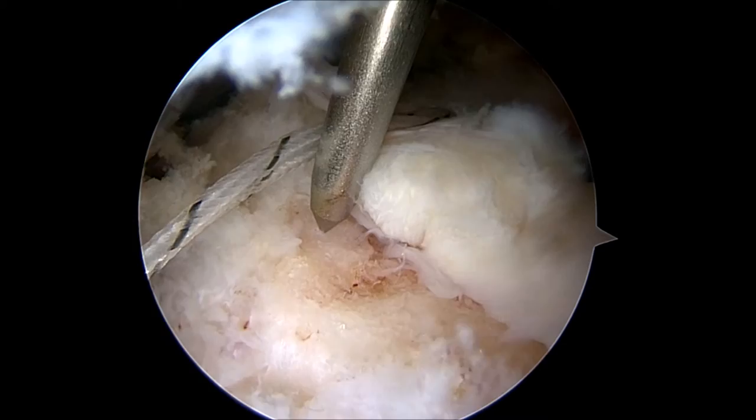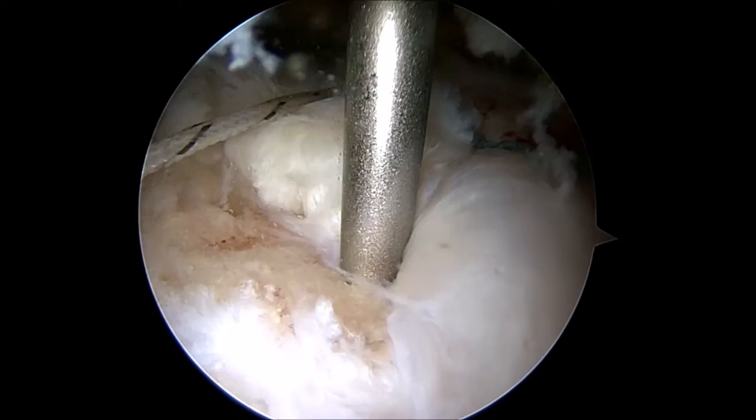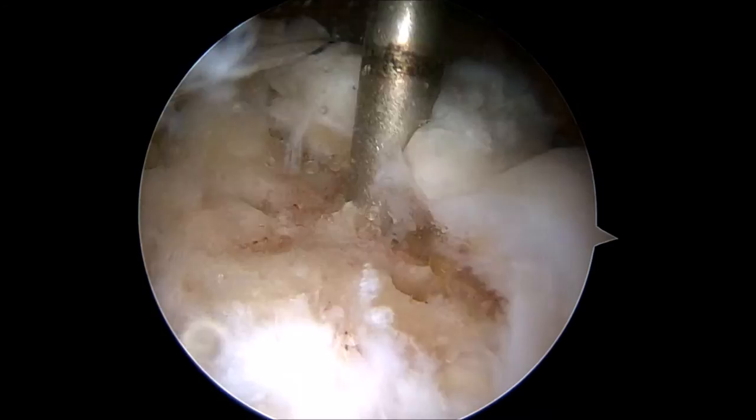Then the awl-type device is reinserted and is used to punch holes into the bone of the humeral head to create vents that allow bone marrow to seep out. The bone marrow brings growth factors and healing elements which increase the likelihood for successful rotator cuff repair healing. The yellowish droplets represent bone marrow seeping out of the bone marrow vents.